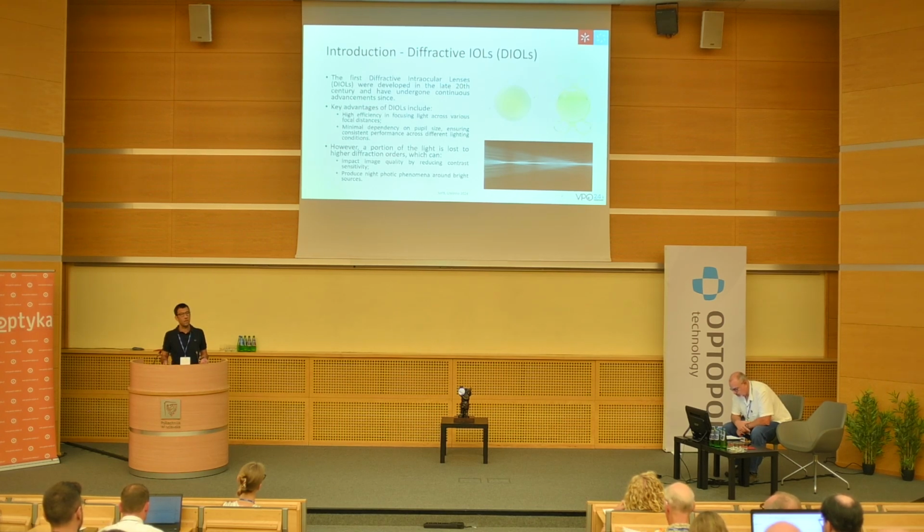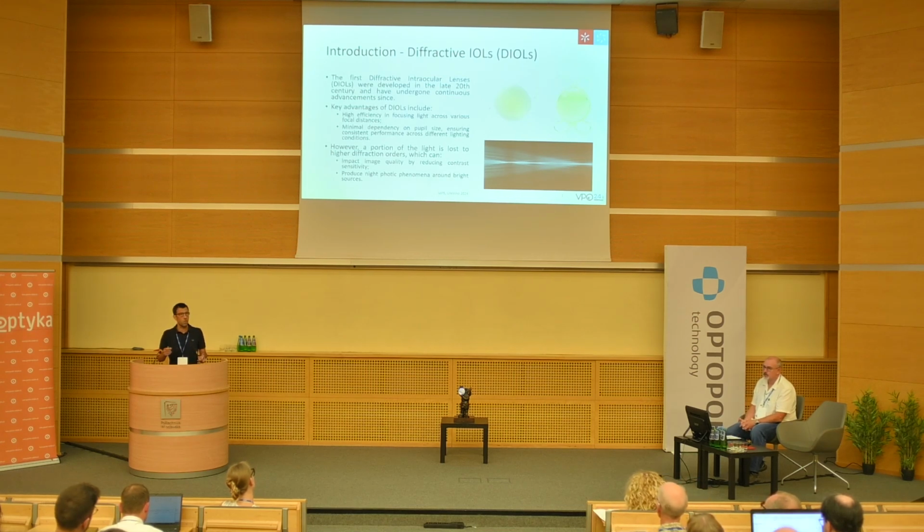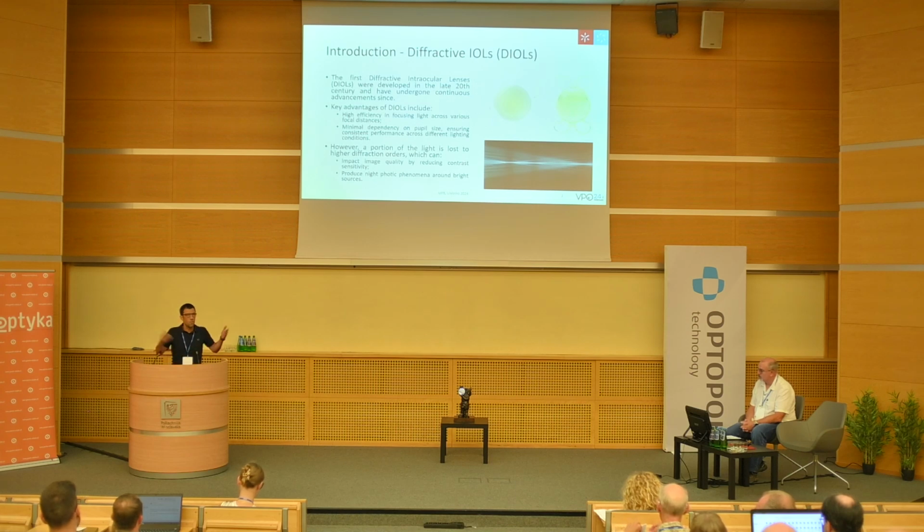Diffractive IOLs have many advantages as presbyopia correcting devices, because they are very efficient in focusing light in discrete points. So you can have bifocal, trifocal and other focal lenses with this type of structures. They are not new. They were developed for biomedical purposes in the late 20th century, and they've been quite improved since then. Every year we see a new model, so now the market is full of new IOLs.